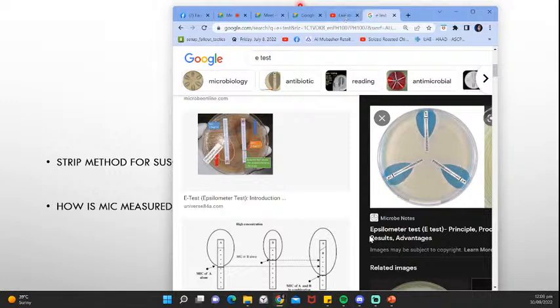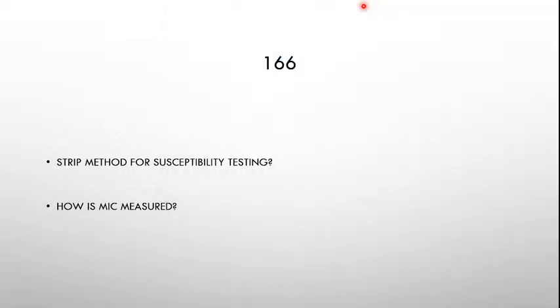And you can also use, by the way, an epsilometer. There are machines that are capable of doing it right now. Okay? So, depending on the type of laboratory that you have.